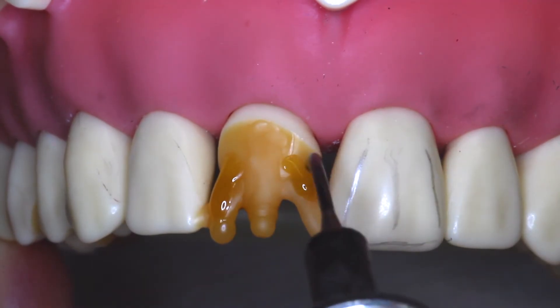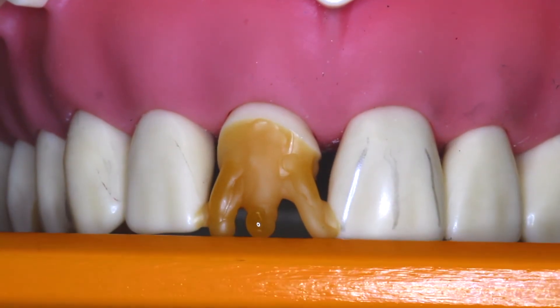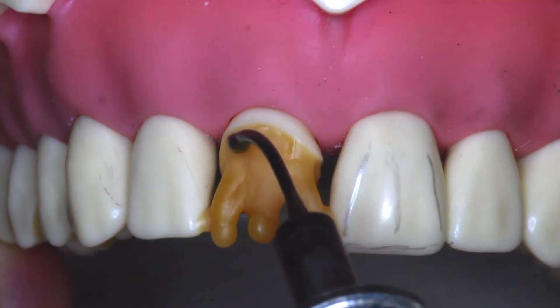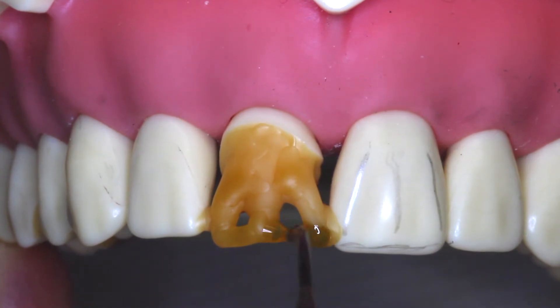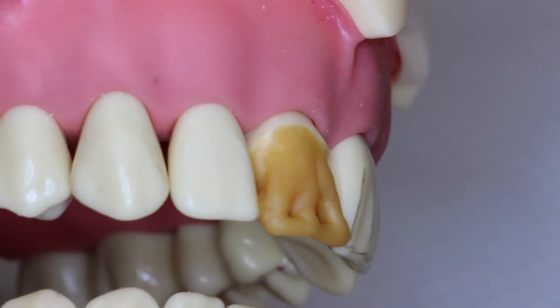One thing you can notice about this wax up is I'm having a little difficulty controlling my wax because the waxing instrument is a little bit hot. These are the things you need to watch for when you're doing your wax up. Notice when I add the wax, I can't get it to connect — that tells me my instrument is a little too warm. Letting the wax application cool briefly in between adding more will keep it from running away from you. Notice the incisal edge is now a little short; we'll come back to that.